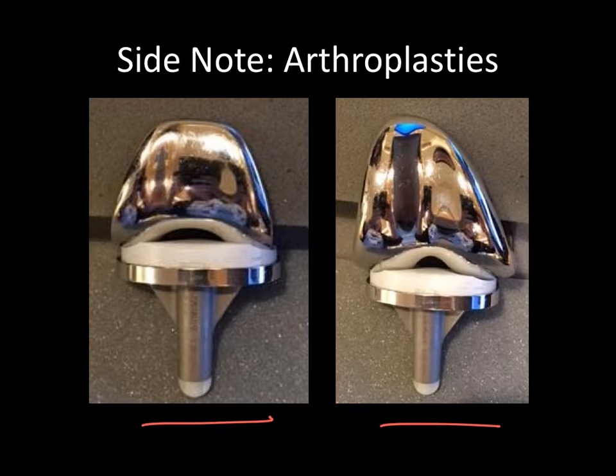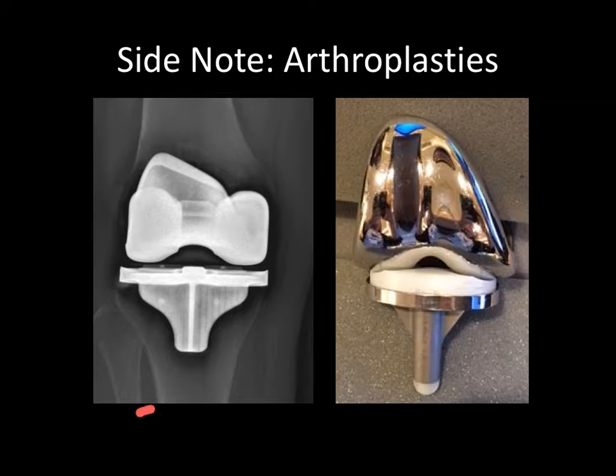and this is important to remember when looking at the femoral component on radiographs. For the prosthesis on the left, we can use the symmetry of the components to help us evaluate whether the knee is rotated. For the prosthesis on the right, we can use the symmetry of the notch. This is what it would look like on a radiograph. Just store this in the back of your mind and we will discuss it in more detail soon.